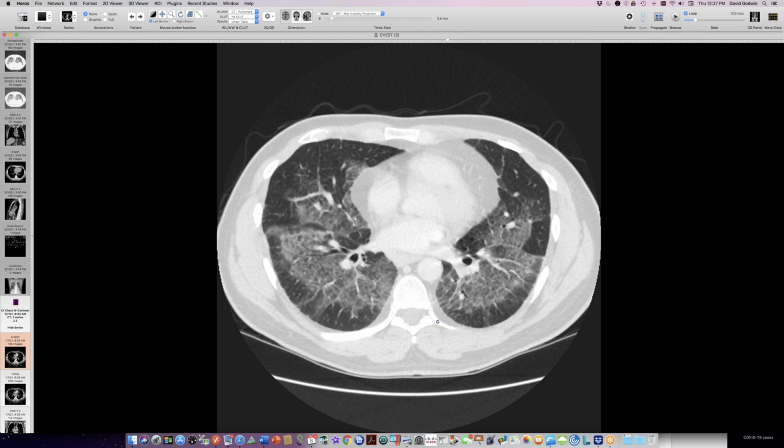Okay, guys. Well, thank you for not making me feel ridiculously inept. And just to your comment about Rosai-Dorfman, that wouldn't go away with steroids either. Well, it might. But that pronounced? Usually it's progressive. What was the time frame between the two scans? Just a month. I don't know. Okay. Open lung biopsy.